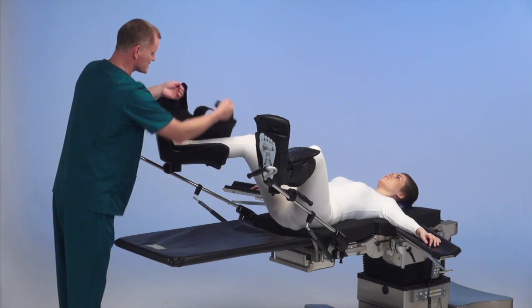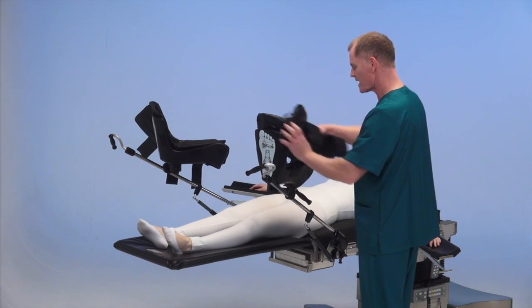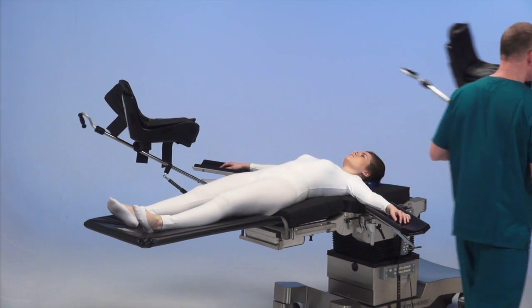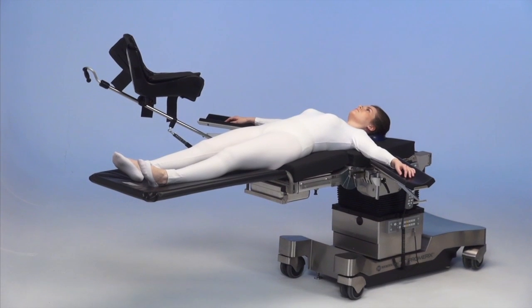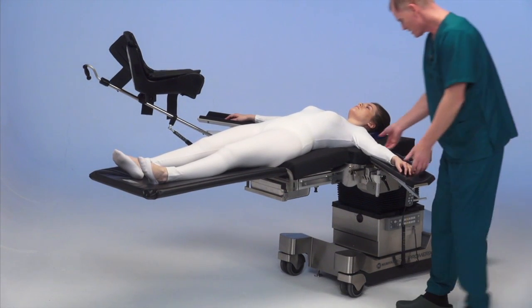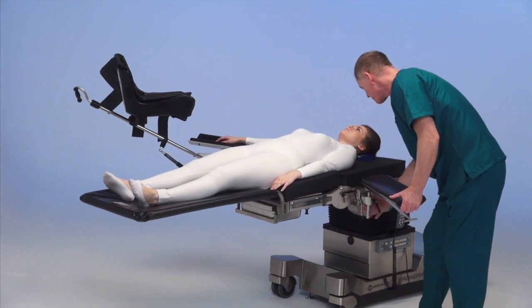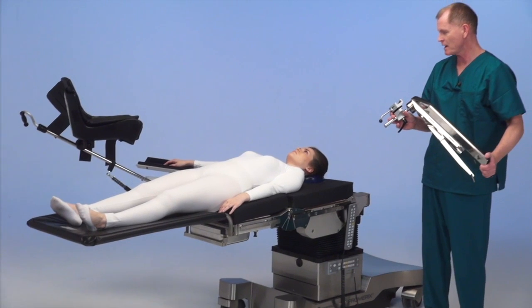We remove the legs from the stirrups and place them back on the transfer board, then remove the stirrup and the armboard to transfer the patient back to the gurney and out of the operating room.